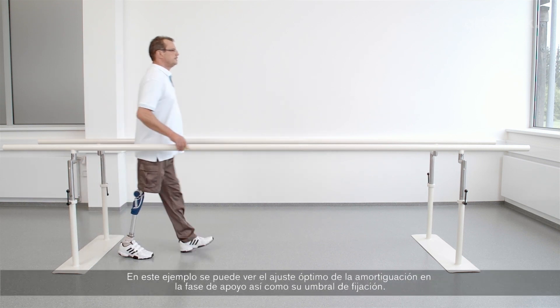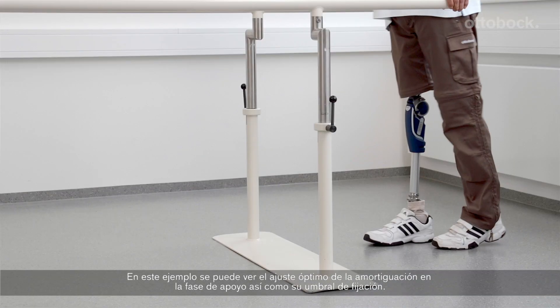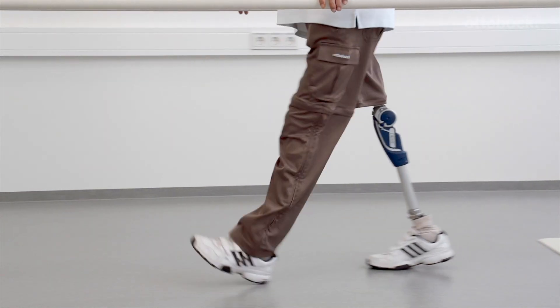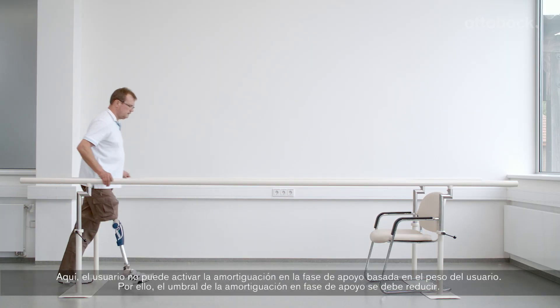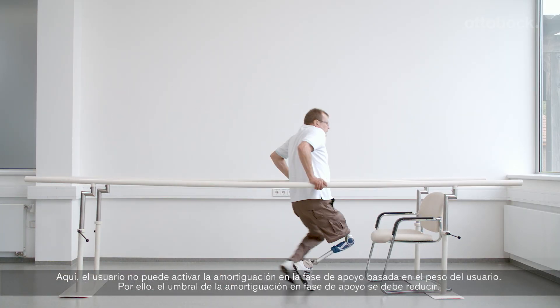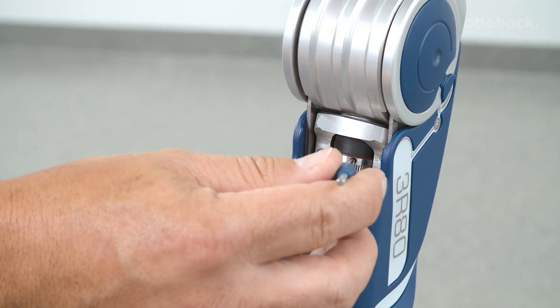In this example, you can see the optimal setting of the stance phase damping and the stance phase damping threshold. Here, the user cannot activate the body weight-based stance phase damping. Therefore, the stance phase damping threshold must be reduced.